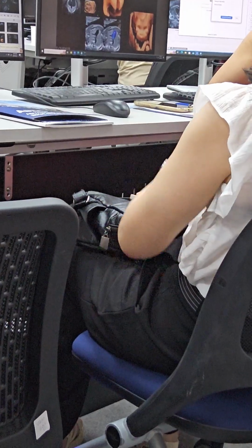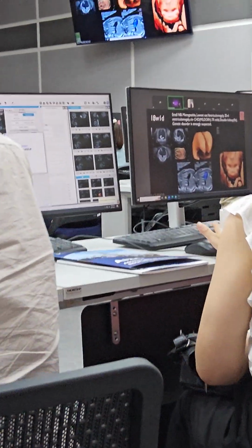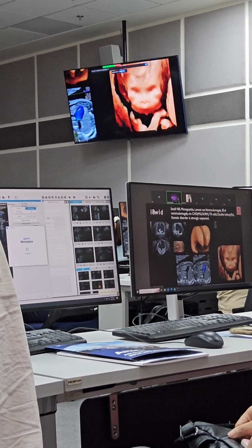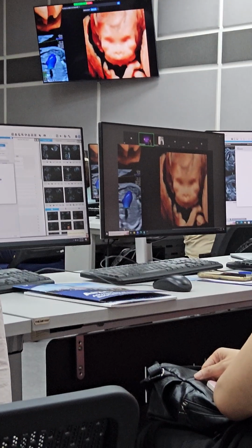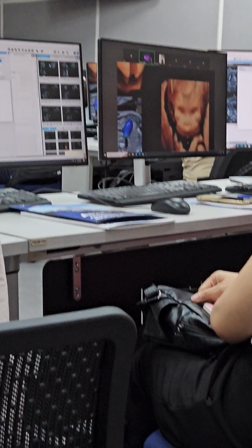Alright? And here you can see this is a very abnormal face. Can you see that? Like this. And how abnormal, I will explain about this.